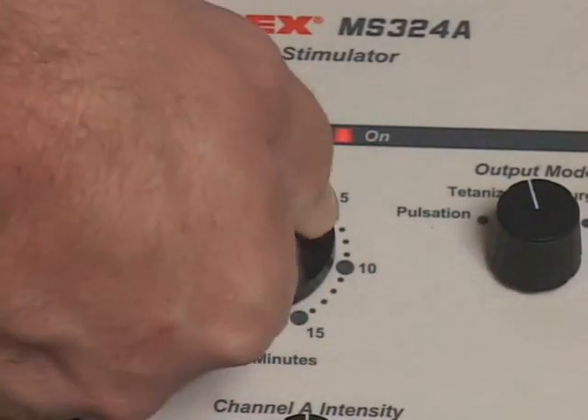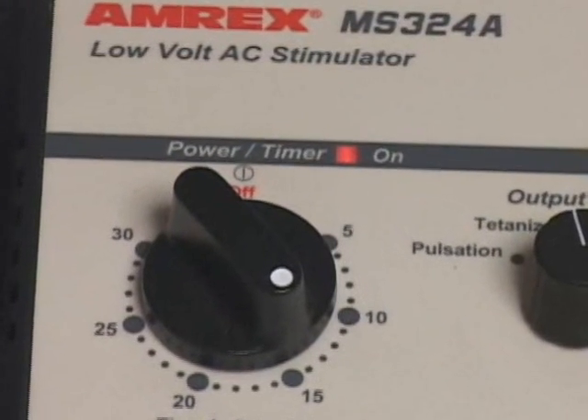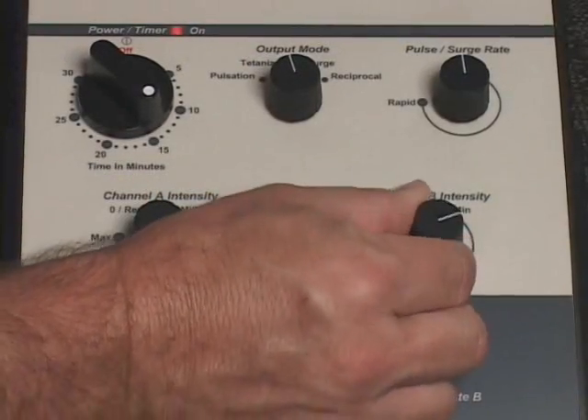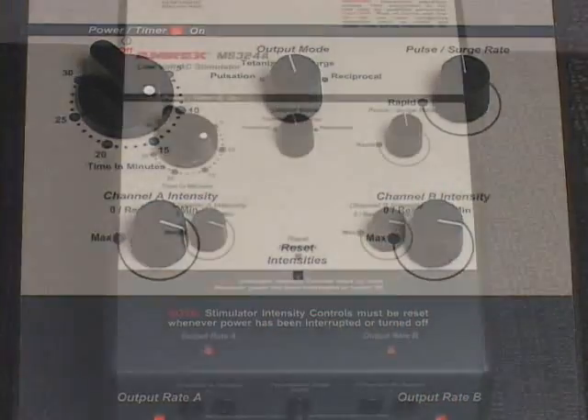Rotate the power timer knob and set it to the desired treatment duration. The stimulator on indicator light will illuminate. Slowly increase the stimulator intensity control or controls to the desired output level or levels.